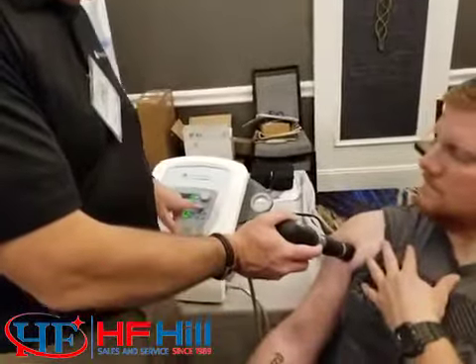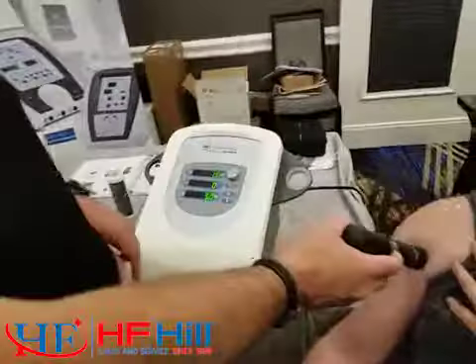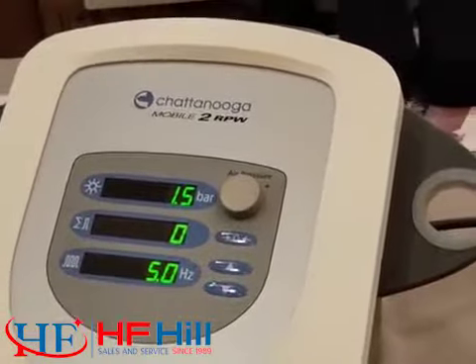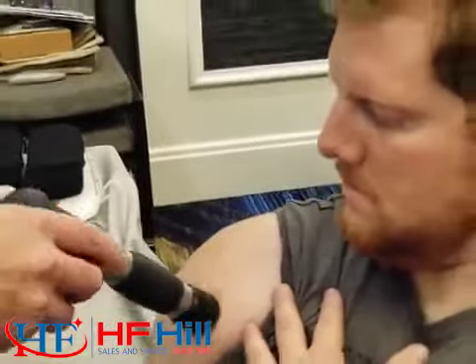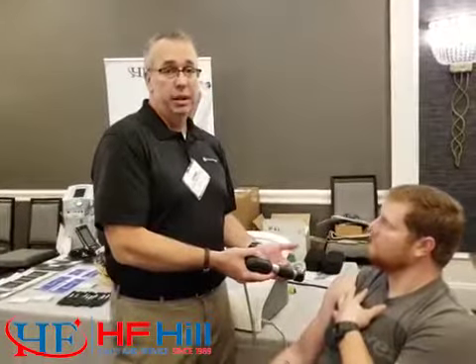Now let's say I've reached my 1,000, and I can reset the counter to start over in case I lose count. Well, it felt great. Yeah, really good. So we're looking for a level of discomfort that the patient can sustain over a period of time. Typically, what you'll find if you've done this right is there's going to be some redness.